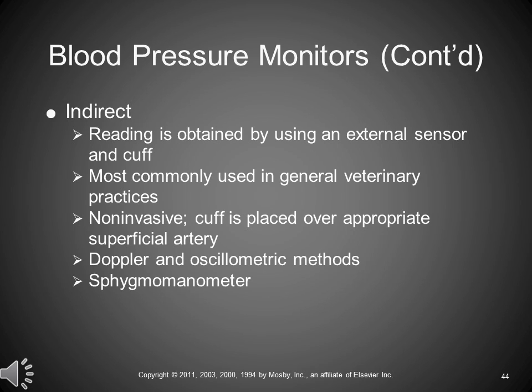You can also use a Doppler and some other oscillometric methods. I'm not a big fan of Dopplers because that sound they make through the whole surgery drives me absolutely nuts. Okay, but some people love them, and if you don't mind the obnoxious noise, they are a remarkably good way to give you blood pressure monitoring, and they're pretty cheap.